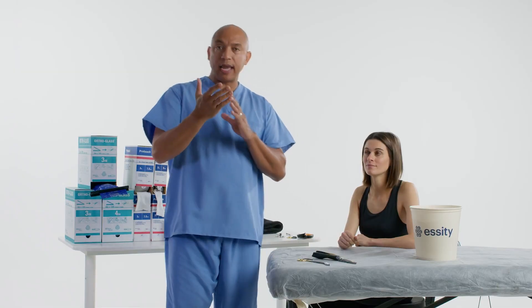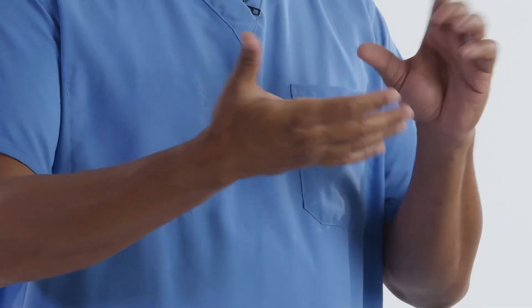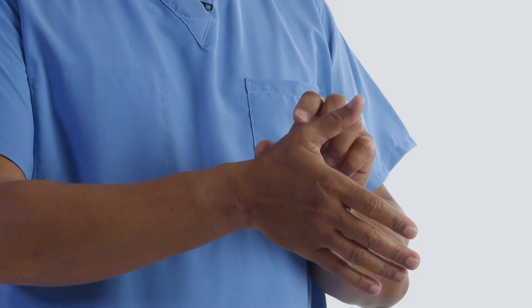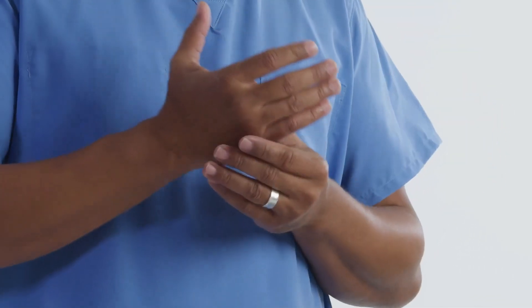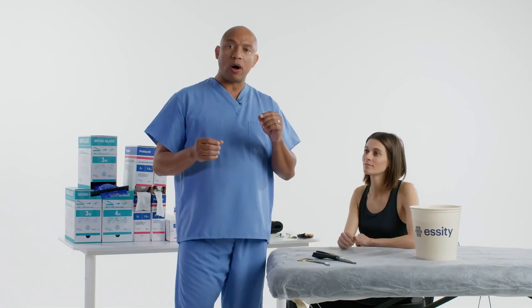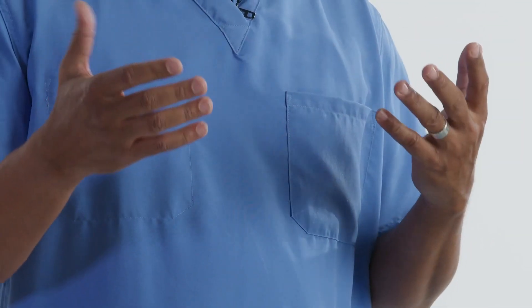For this particular occasion, I don't want the patient to take off the splint, but it's important that we keep the position right. This is for injury to the phalange, the metacarpal, the carpals. In particular, there could be a scaphoid fracture where there's a high risk of avascular necrosis, malunion, or non-union.